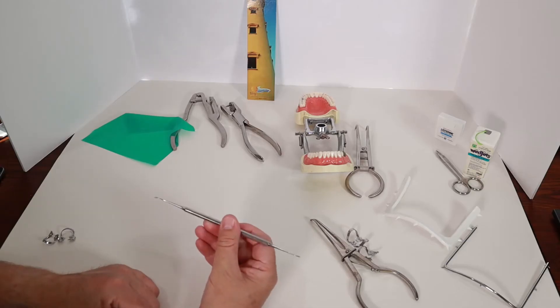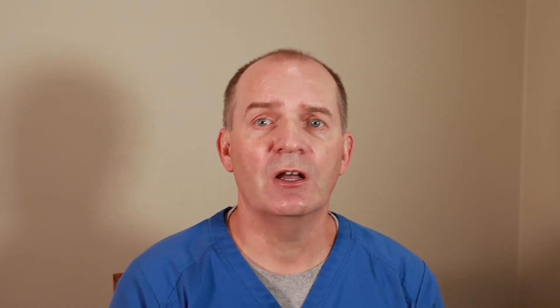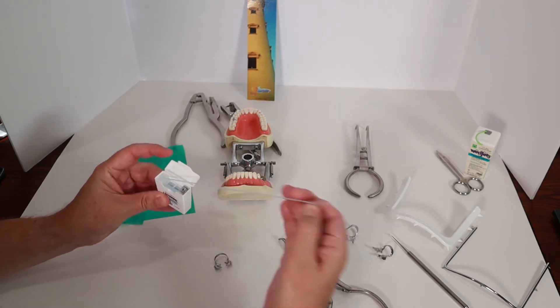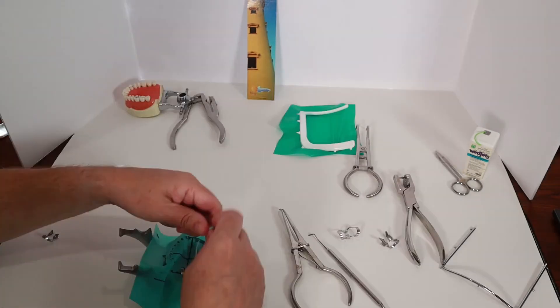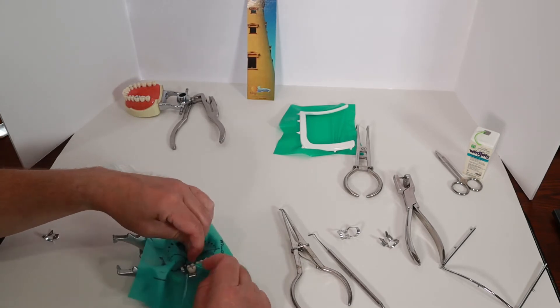The last tool I'll use is a dull-edged instrument, such as this plastic instrument which I use to place white fillings. I'll use it to tuck the rubber dam completely under the clip. I'll also use some dental floss to tuck the rubber dam down in between the teeth. This step is very important when I'm placing the rubber dam around multiple teeth.